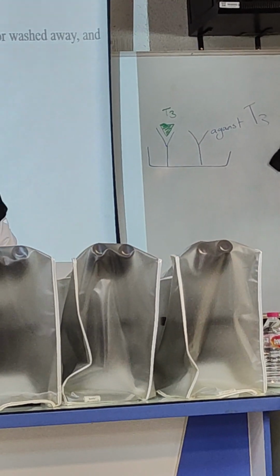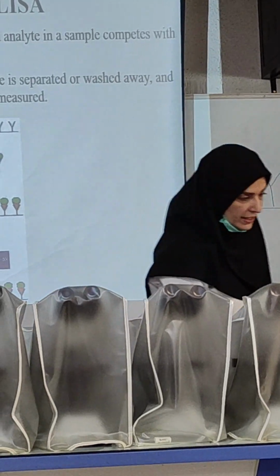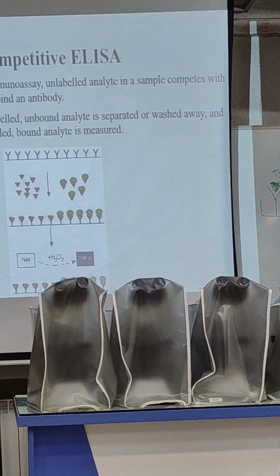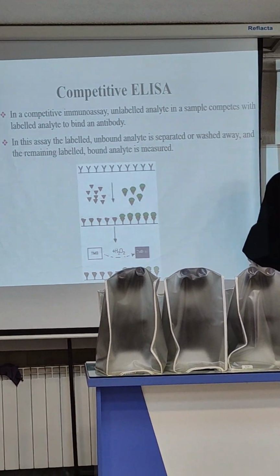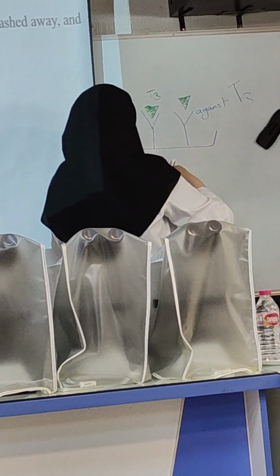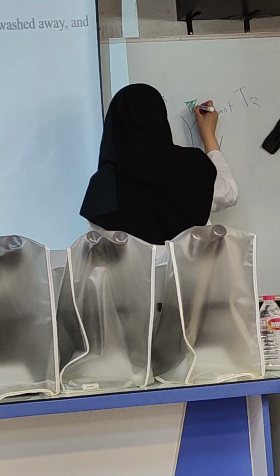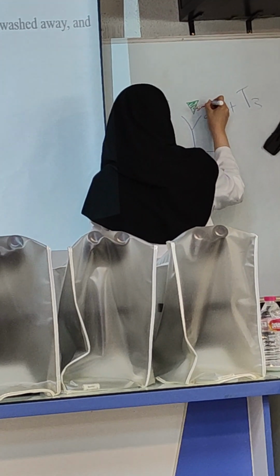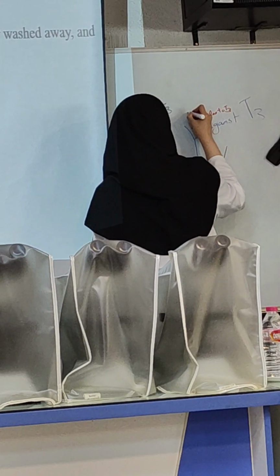When we say this is a competitive ELISA, it means that when you add the tracer, it is a very, very similar molecule to T3, but not T3.